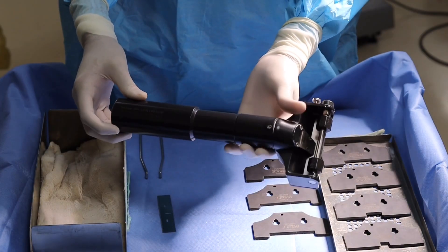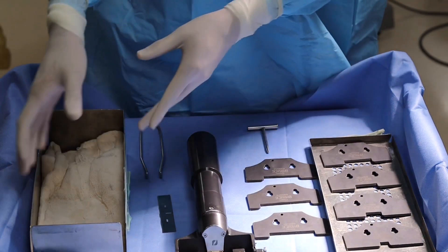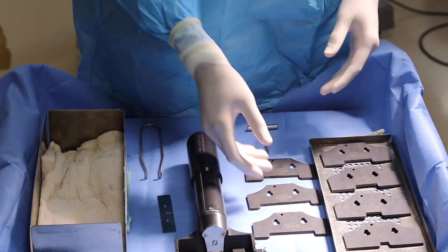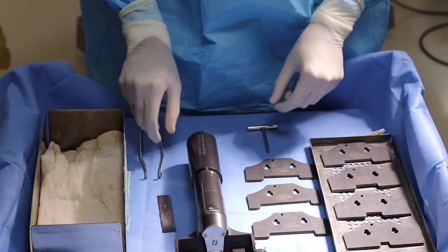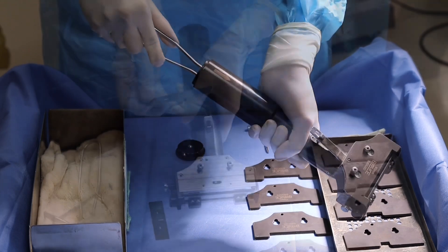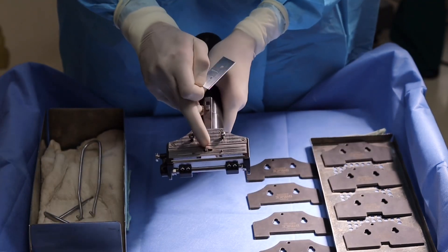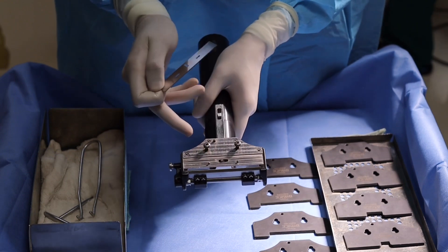This is the battery-powered dermatome which we use in our department. It has various parts which includes a sterilizing case, graft plates of different sizes ranging from 1 cm to 8 cm (10 mm to 80 mm), a graft blade, and a 3000 mAh lithium battery. There is a lever for holding the graft blade and two screws for holding the graft plate.